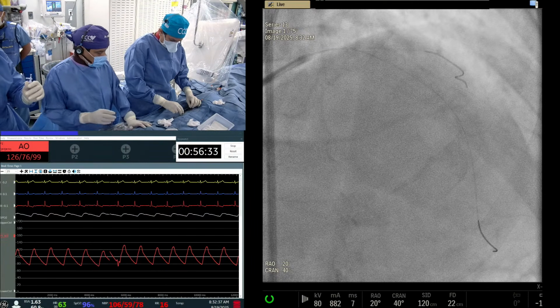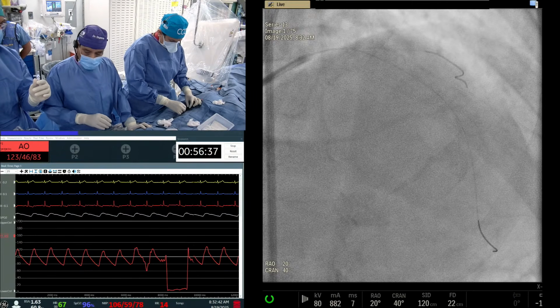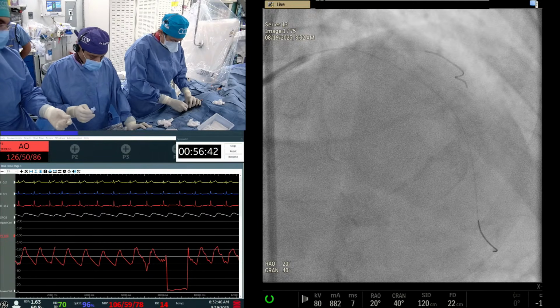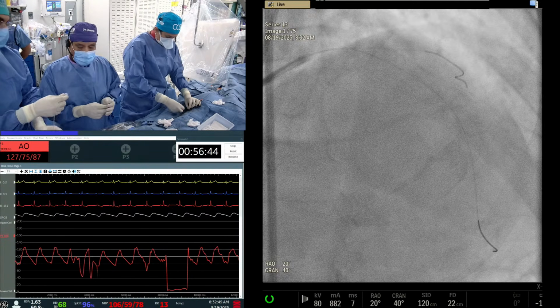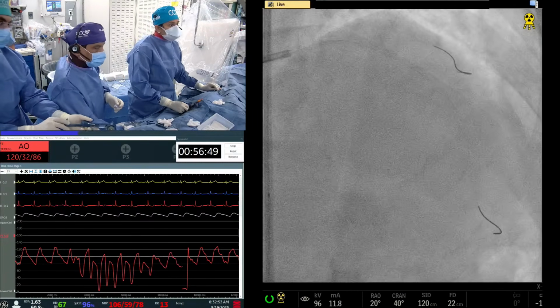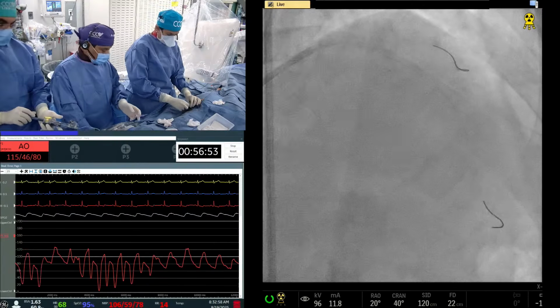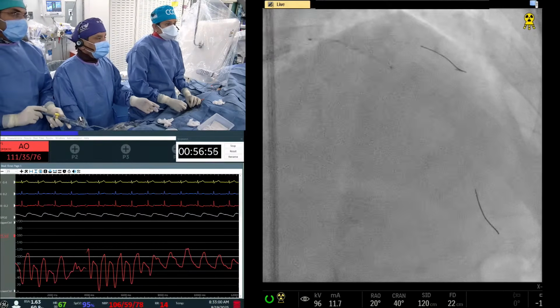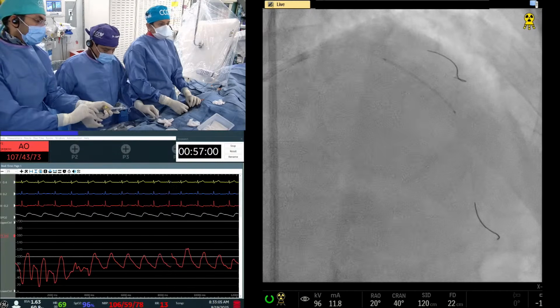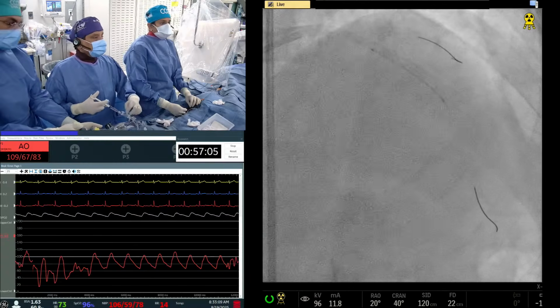I was unaware of this company, Nipro. Nipro has a lot of products available in India. Is it European? No, I think Japanese. And they have a very nice guideliner also. Very nice guideliner, very soft and goes in. Unsurprising. A lot of innovative technology does exist in Japan. I bet they have improved our.